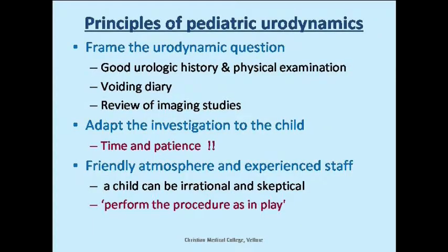Now, I don't think you should do a urodynamic study unless you know what you are doing it for. Because if you don't know what you are investigating, and just because the patient has a posterior valve, you do a urodynamic study, I don't think you will get an answer. The famous saying, you put rubbish in, you get rubbish out, is significantly true for any urodynamic study.